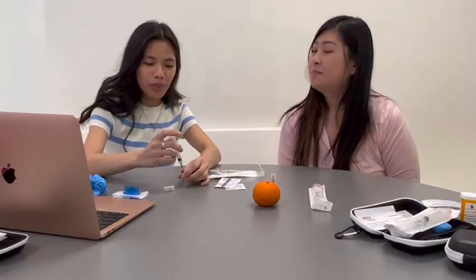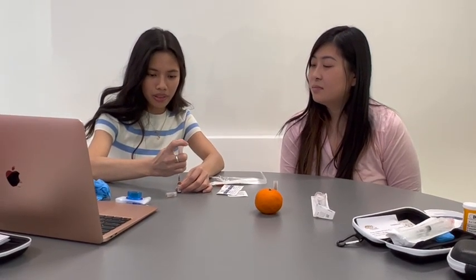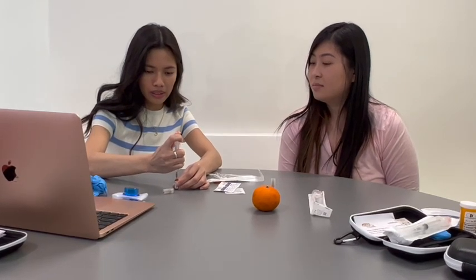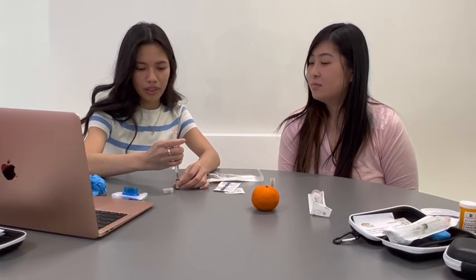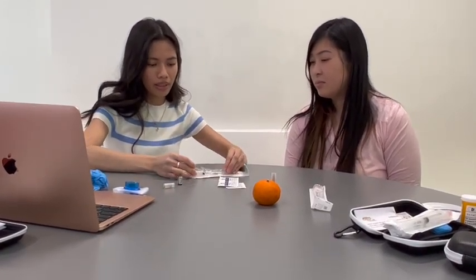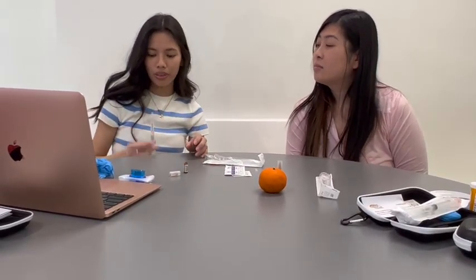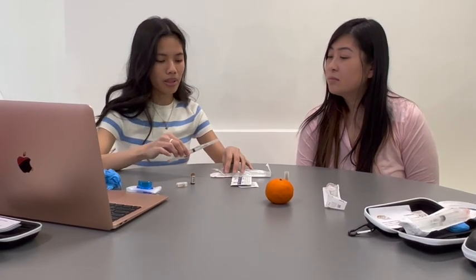Then drop the medication from the ampule. Just take everything out. And you want to cap that back in. One thing you have to make sure of is that there's no air in the syringe. You could tap it like this and bring all the air up, and then push the air out of the syringe. And that one's done. That one's ready.